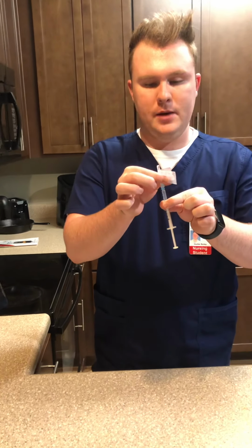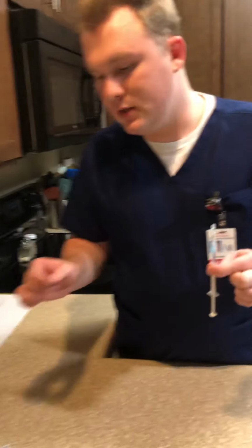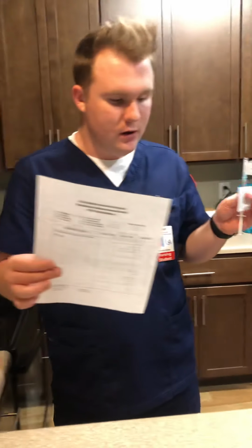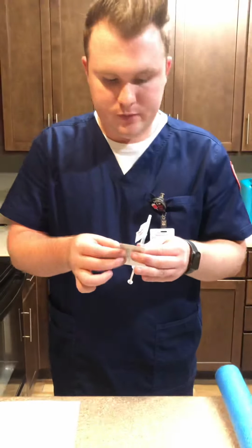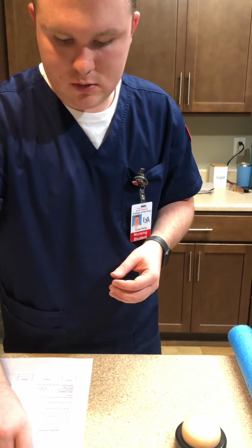So it's out of my way. Now that I have it, I am going to take an alcohol pad with me and my MAR, and I'm going to proceed to the patient's room. Okay, so knock knock, come in the patient's room. Okay, I'm going to set my supplies down on the counter, and I'm going to perform hand hygiene. And now I'm going to verify my patient using 2 patient identifiers.